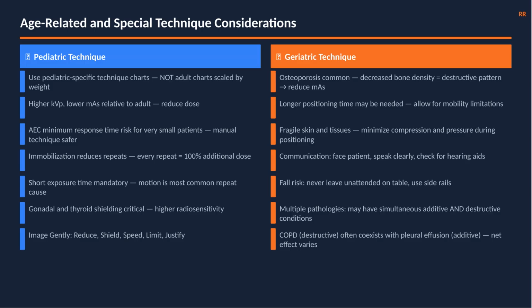Manual technique may be safer. Short exposure time is mandatory. Motion is the most common cause of pediatric repeats. Image gently. Reduce, shield, speed, limit, justify.